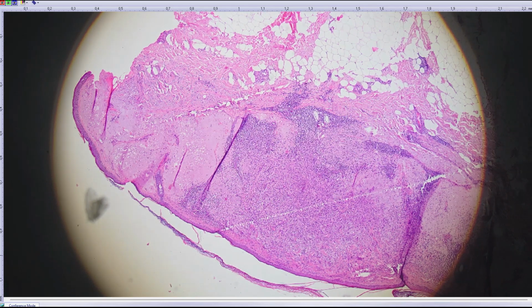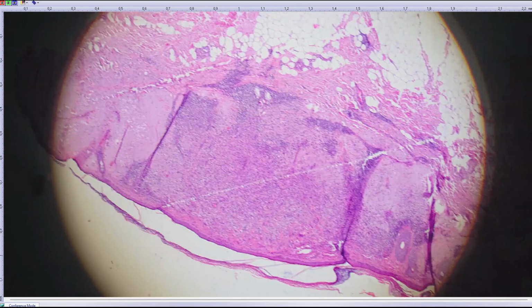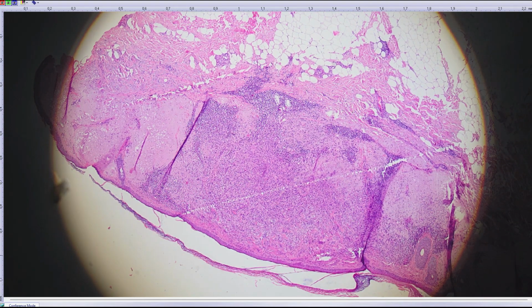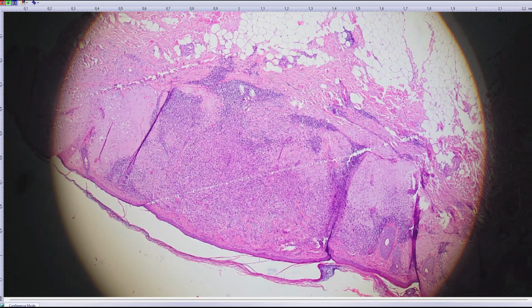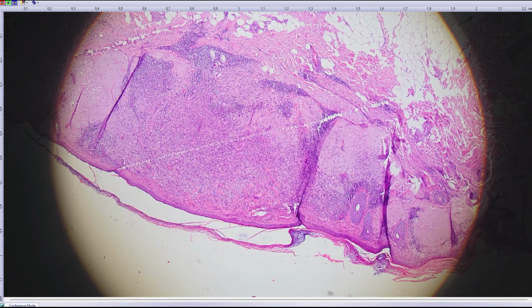Yes, that's your opinion, but in the literature, I'm sure of it. Yeah. Yes, that doesn't mean anything though for the general public. Yeah. So I'm saying what's in the classification and how we are classifying things. So atypical fibroxanthoma by definition is basically this. If you call it superficial sarcomatoid squamous cell carcinoma, nobody can tell really. I think that you are incorrect, because at the end there is focal P63 positivity as well.